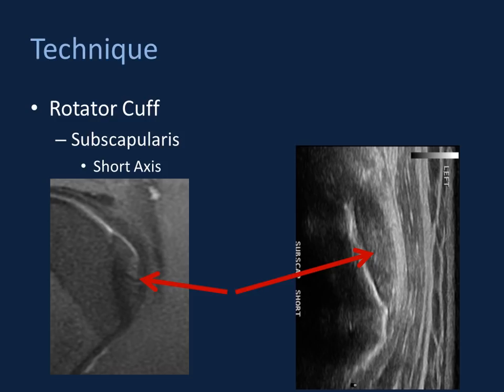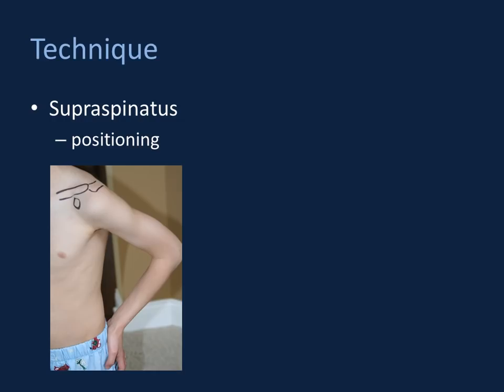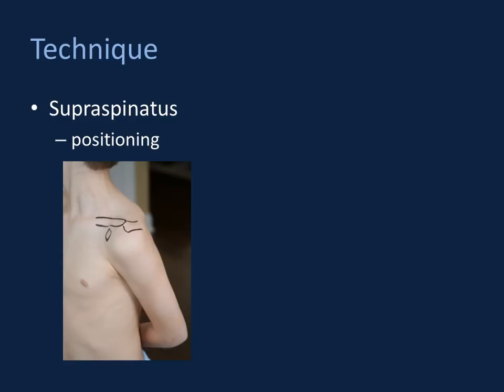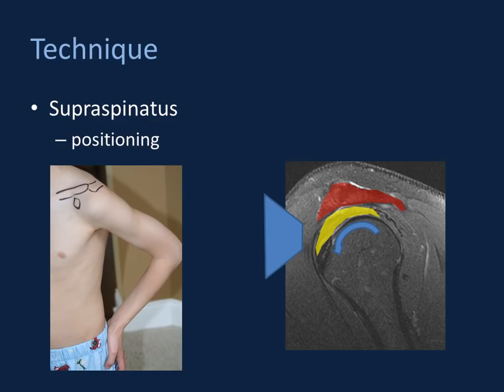Moving into the supraspinatus, we need to get more creative with shoulder positioning. The osseous components of the coracoacromial arch — largely the acromion and clavicle — obscure the majority of the supraspinatus tendon. To image it well, we often need to add some anterior rotation to the humeral head to expose those tendon fibers to an anterior acoustic window. Placing the patient's hand on their back hip — as if putting it into their jeans pocket — provides some anterior rotation of the humeral head and exposes the supraspinatus tendon tissue anteriorly.